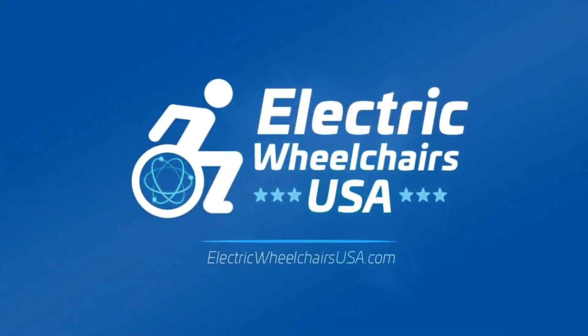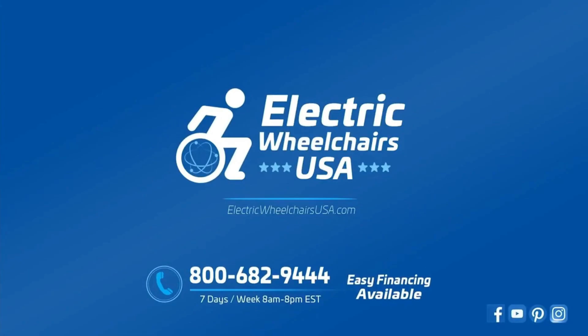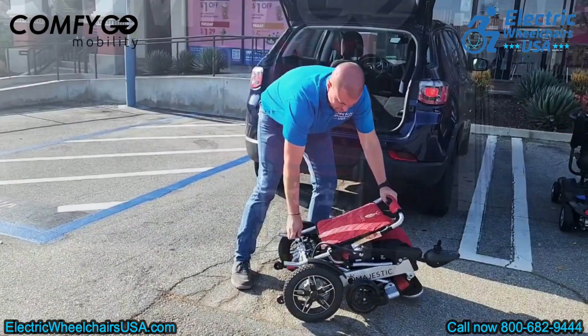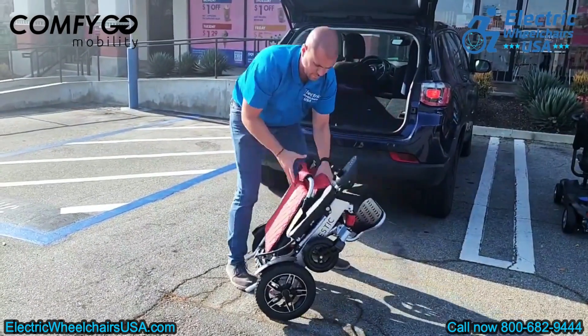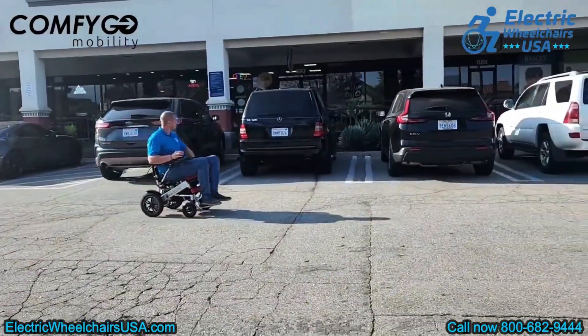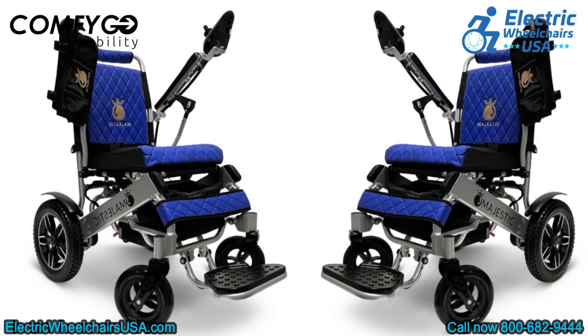Hello, and welcome to the Electric Wheelchairs USA Mobility Experts channel. Today we'll be taking a closer look at the IQ8000. This model is part of ComfyGo's Majestic series of folding power wheelchairs. It's airline-approved and has a weight capacity of up to 330 pounds. You can also personalize it by choosing different cushion and frame colors.